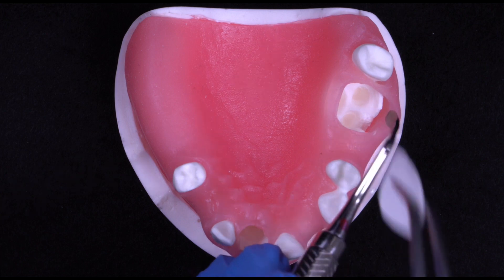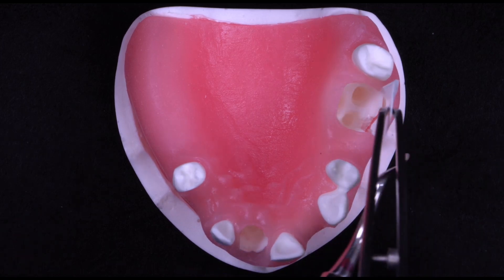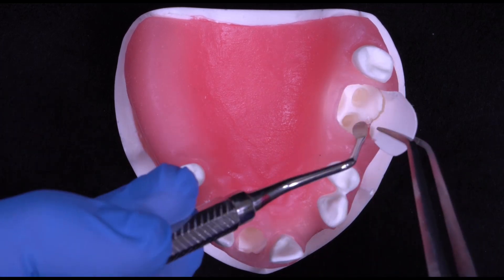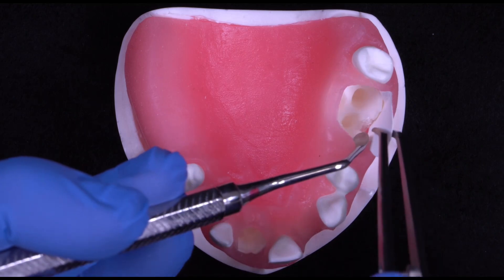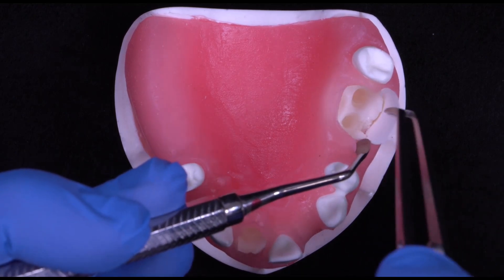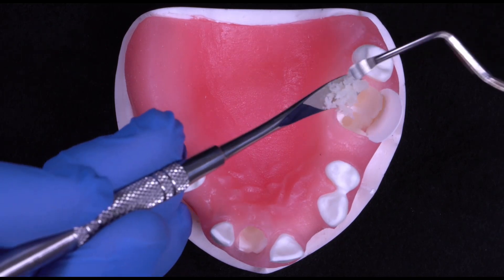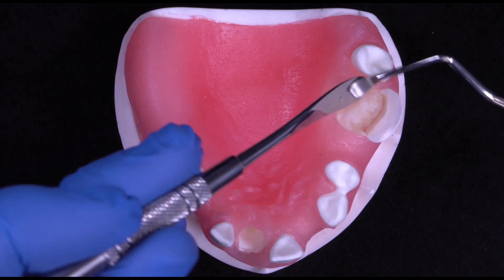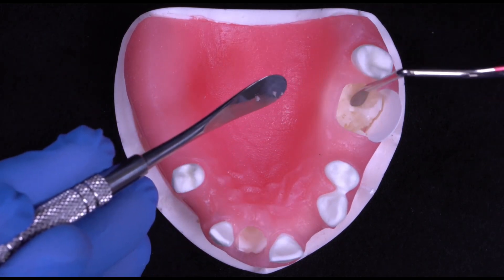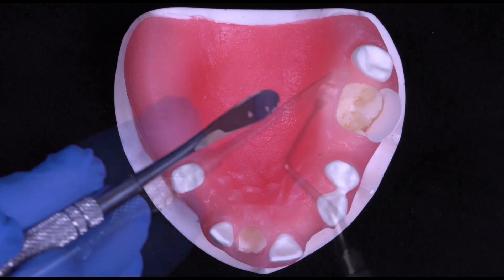Once reflection is complete, the collagen membrane can be placed below the defect between the buccal soft tissue and the bone to create a barrier. Using Creos Allogaine bone particulate, the bone can now be transferred and placed into the extraction site.